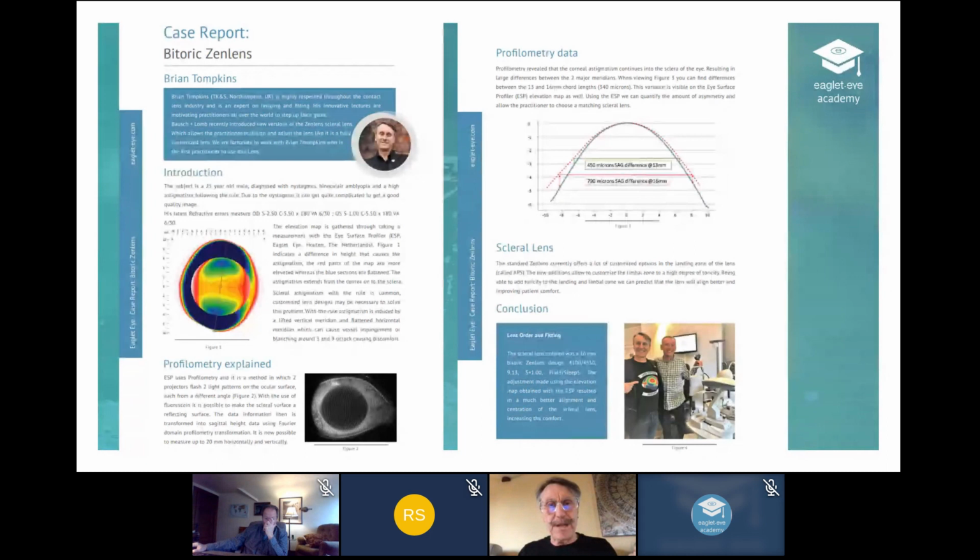But ultimately, we were trying to fit from fitting sets and getting further and further and more complicated with the lenses. And we were having lots and lots of multiple designs, and it just wasn't working. And every single design was digging in the wrong places, etc. So in the end, we got some really good images. Sean will just stay still for a couple of seconds sometimes.